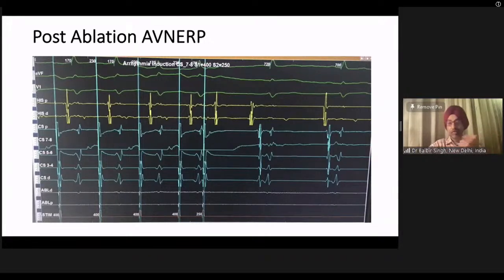And there may be an AV node reentrant tachycardia which may be going on, and you may miss that completely. In this patient, this tells you that probably that antidromic tachycardia was an AVNRT with a pre-excited tachycardia down the accessory pathway, which possibly is the cause, though I have not done a His bundle refractory PVC during the antidromic tachycardia because the catheter wasn't there. And when I got the catheter, it got converted into an orthodromic tachycardia.